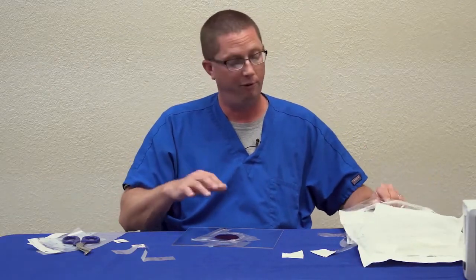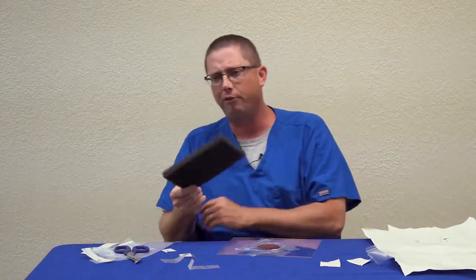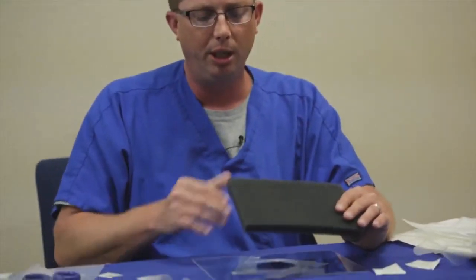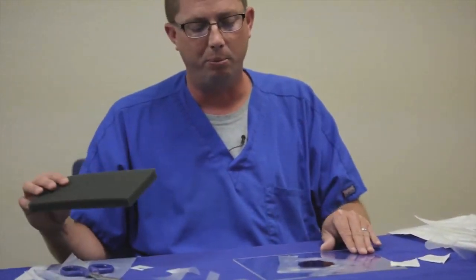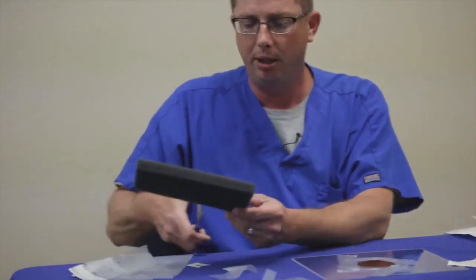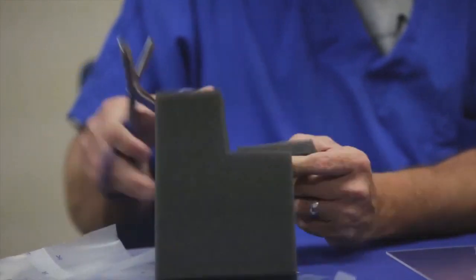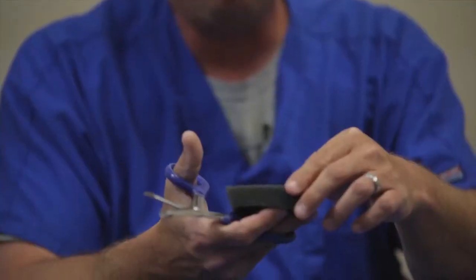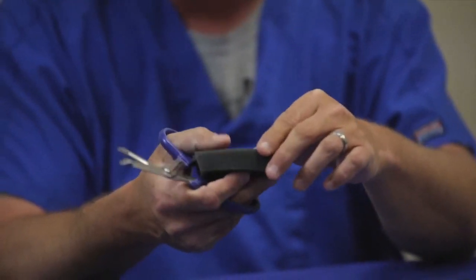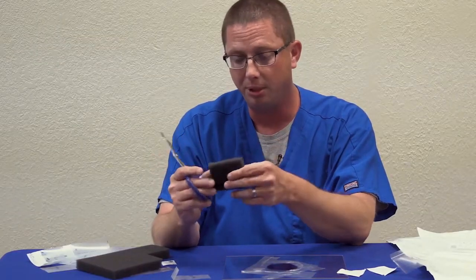I want to apply the foam media for negative pressure. When cutting the foam, you never want to cut foam above the wound base. Debris can fall into the wound, and you should always cut the foam away from the wound base. At this point, I usually cut the general size of the foam. And you want to ensure when you cut the foam that it touches the entire wound base. If it's not touching the entire wound base, negative pressure's benefits will not be applied to that area of the wound.